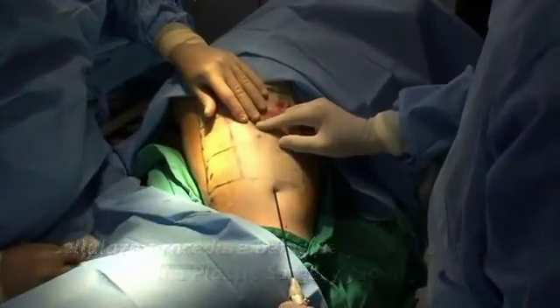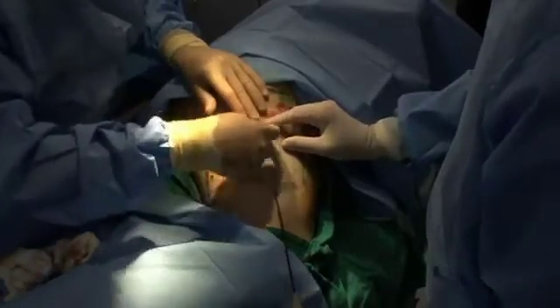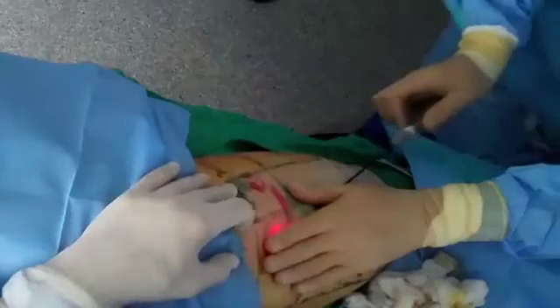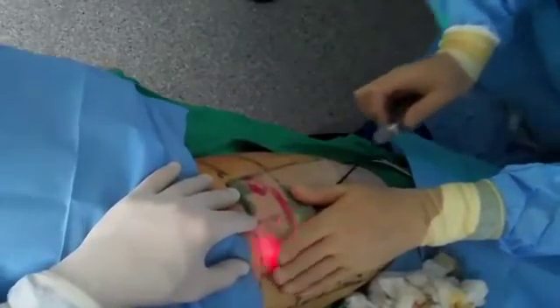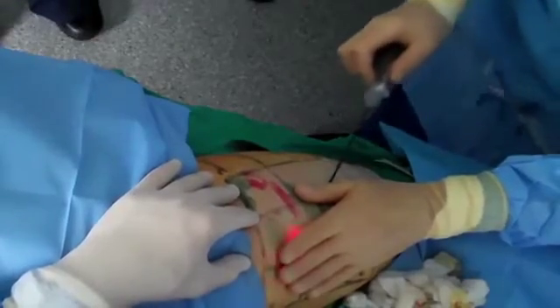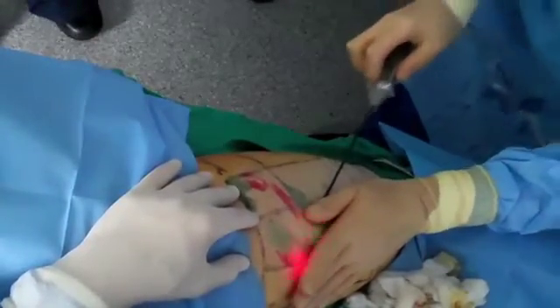And then I'll just place some heat all around, so now I'm just working across and watching temperature. I'm at 43 already. 45. Good. Almost there. They're going to make it to 1,000.